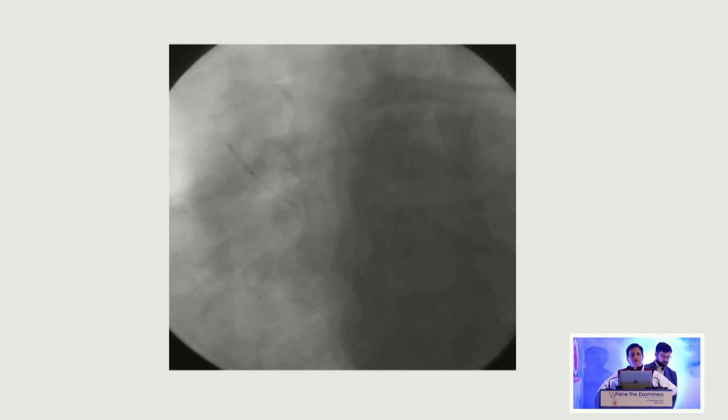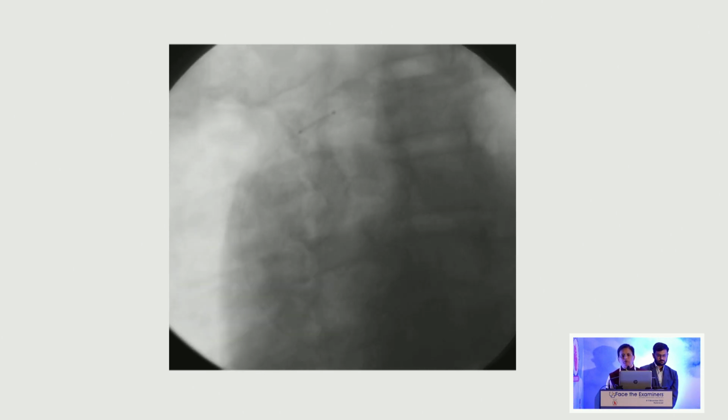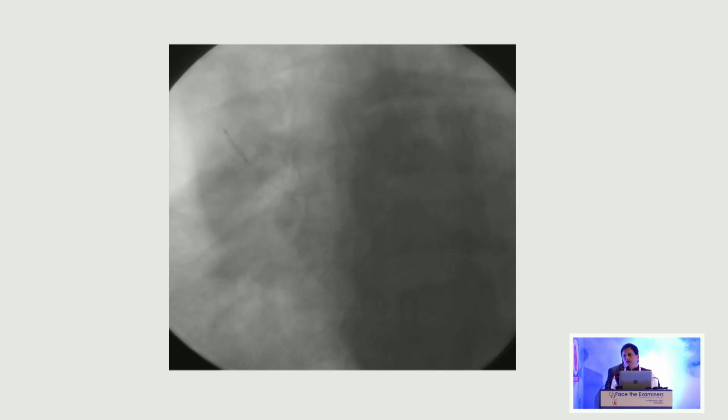Have you ever seen it? So this is what it is. What happened is, we tried everything, failed. I could not by any means cannulate, and at that moment the patient is already in pretty bad shape. No surgeon would touch, nobody would do anything about it. Except for the diagnostic catheter, nothing was going in. And that was a time when this helped me.